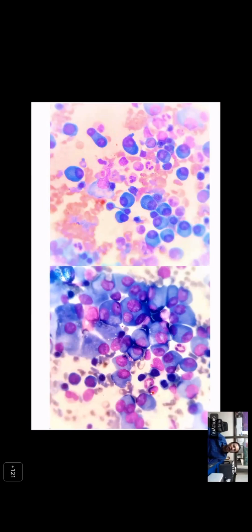So Deepika, do you see any typical feature in this plasma cell? In this picture, plasma cells have an eccentrically placed nucleus. Some of them are showing binucleation. Right. And it also shows nucleoli. See the nucleoli. A normal plasma cell does not show nucleoli; usually it is mature. It has some plasmablastic morphology, because you can see clearly there are nucleoli in the majority of plasma cells.